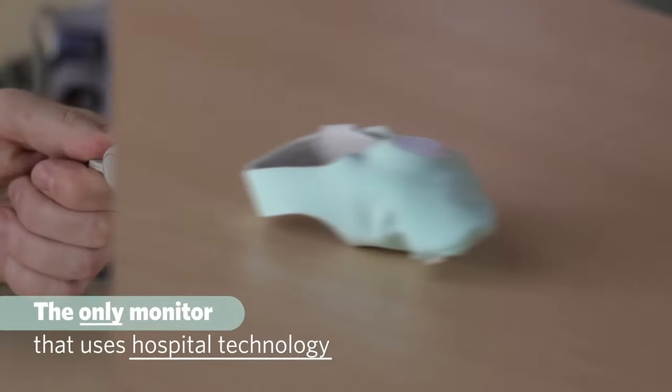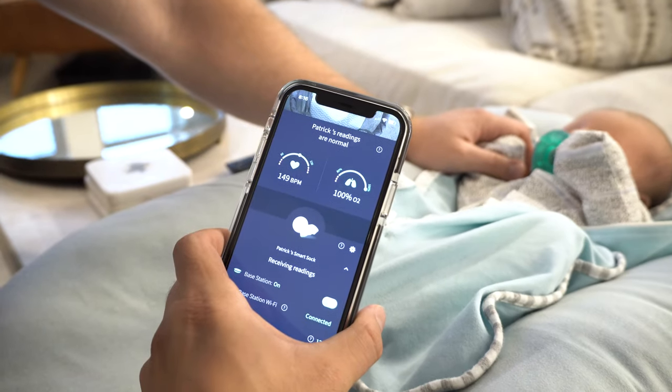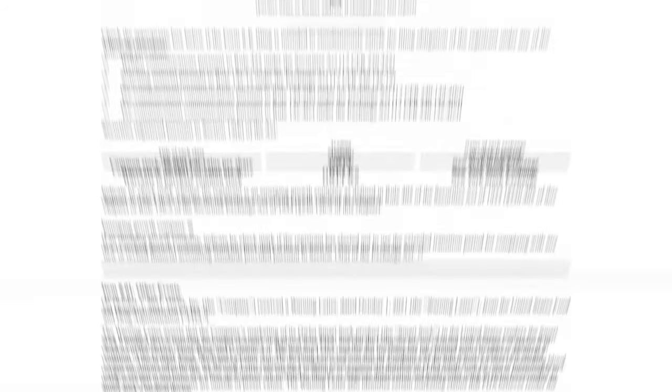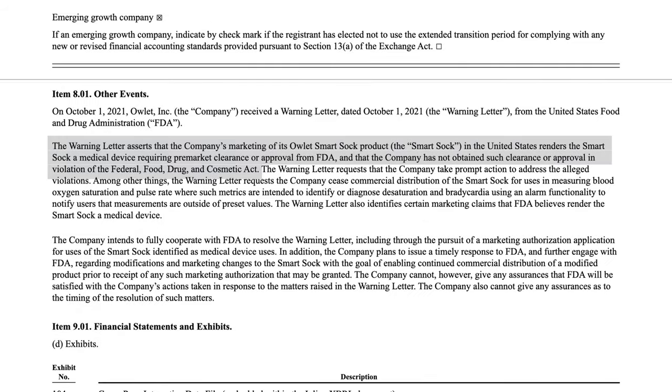The original Owlet Smart Sock was an innovative piece of wearable tech known for delivering real-time heart rate and oxygen vitals on your baby. While it was really popular with a lot of parents — in particular parents of preemies — it came under fire by the FDA, which I previously made a whole video on. Owlet pulled their Smart Sock from shelves, but they'd already been planning their Dream Sock and it didn't take them long to pivot and switch to this guy right here. This is the Dream Sock.